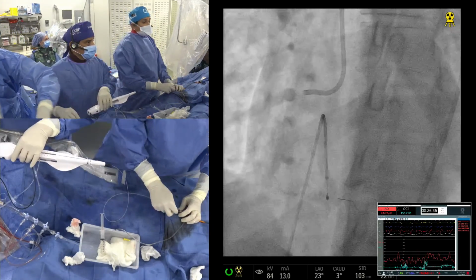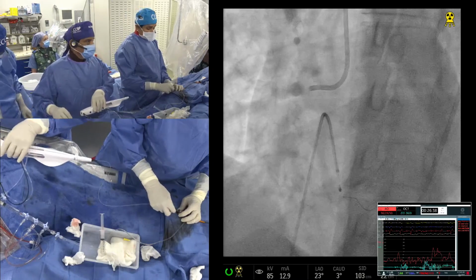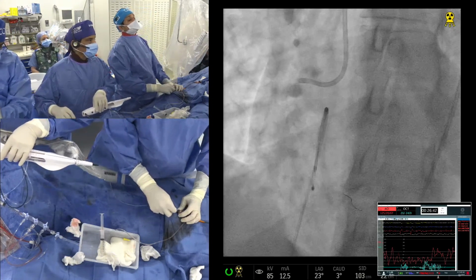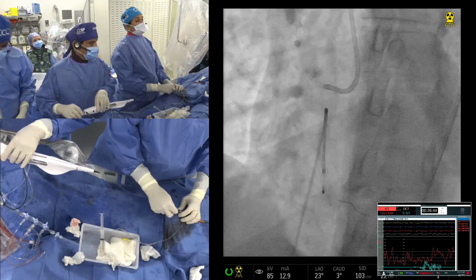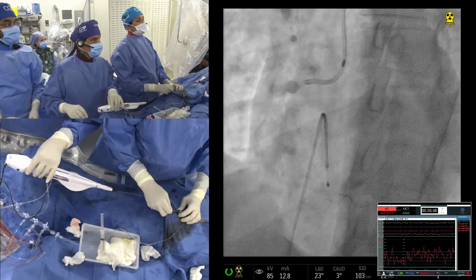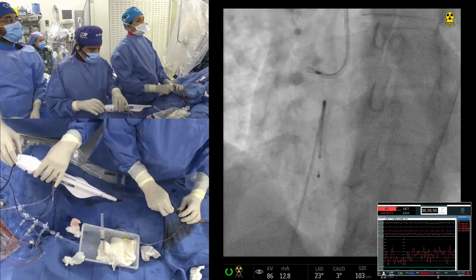I know we picked 1.5 because of two reasons. One, based on the OCT MLD. Angiographically, if we were just going to do the proximal, we could have even gone 1.75. Yeah. Good. Good. Just keep it there.